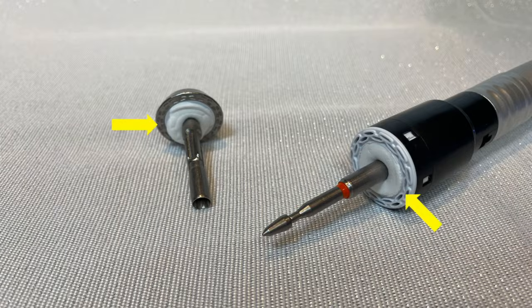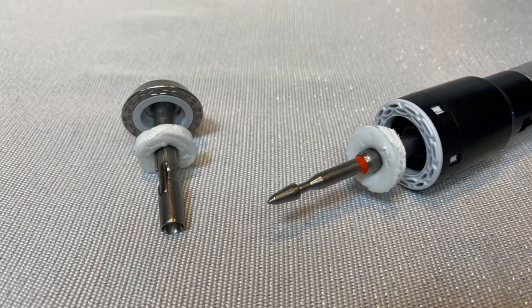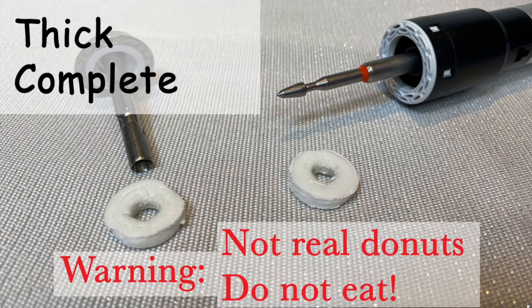When we fire the stapler in the operating room on bowel, the knife blade creates two small rings of tissue in the center that we call, believe it or not, donuts. We want to check these donuts and make sure they're thick and complete, and that is one way that we can tell that we have a good solid anastomosis.